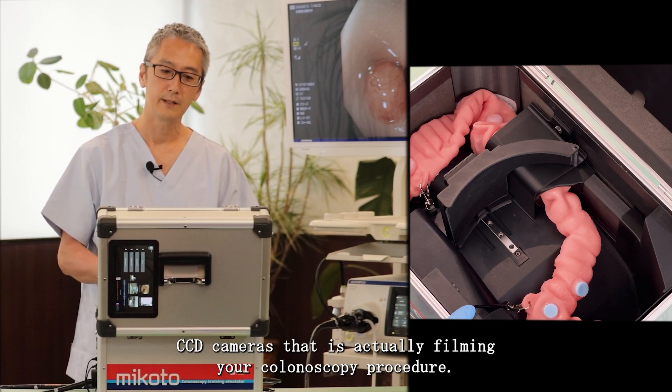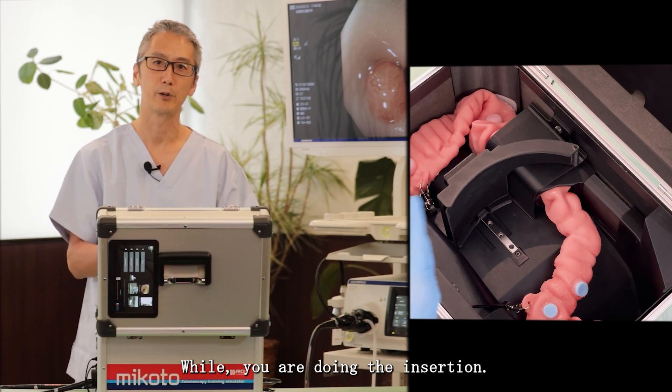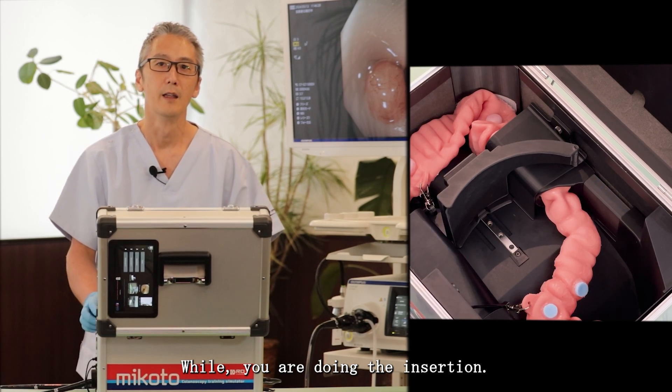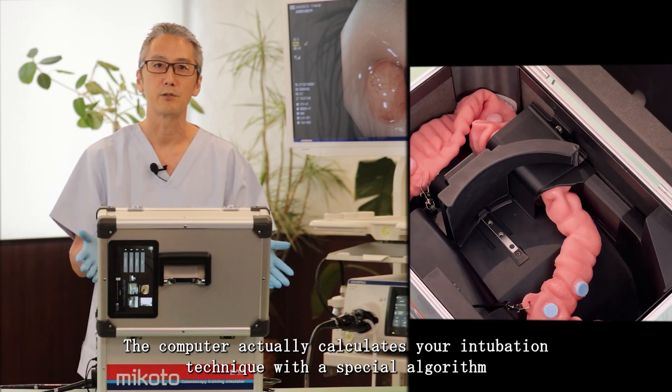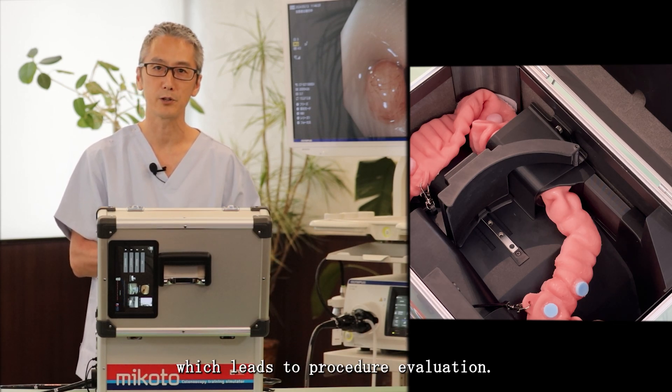It has two CCD cameras that are actually filming your colonoscopy procedure while you are doing the insertion. The computer calculates your intubation technique with a special algorithm, which leads to procedure evaluation.